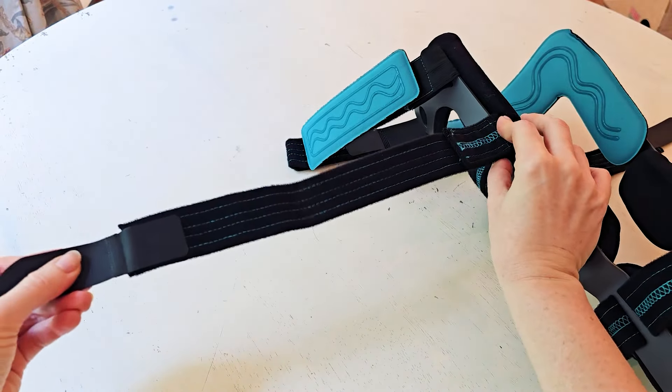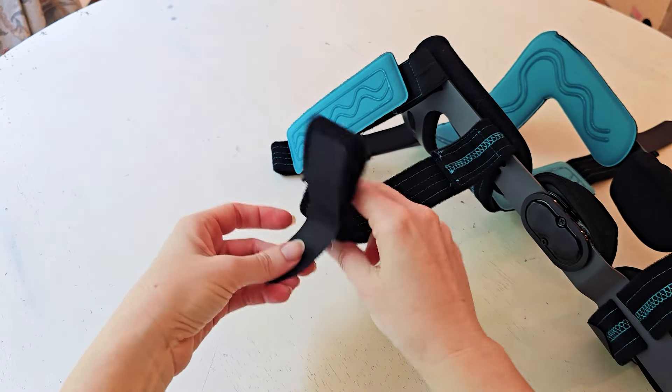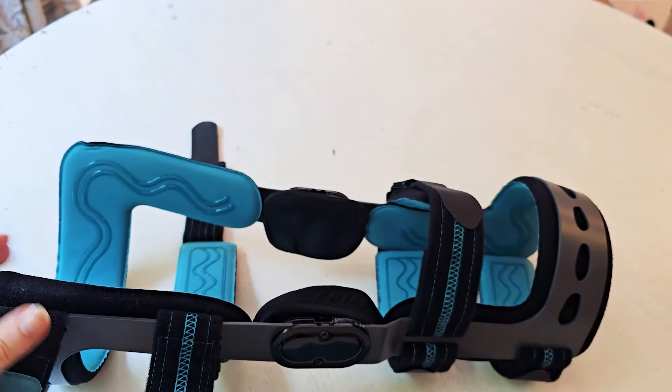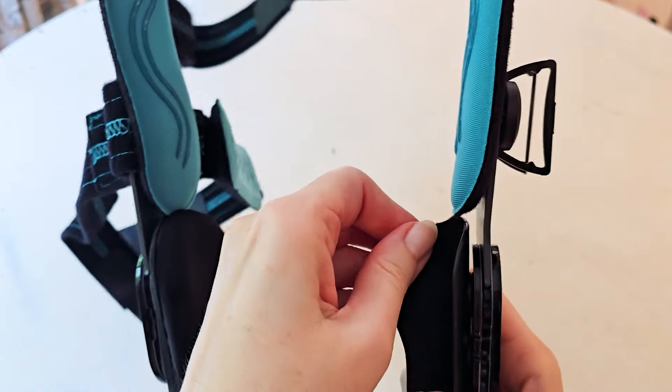You've got the fixed part on the top and the fixed part on the bottom, but everything else is adjustable and customizable. All along the inside there's padding across the whole internal structure — all of that blue part is a padded structure.